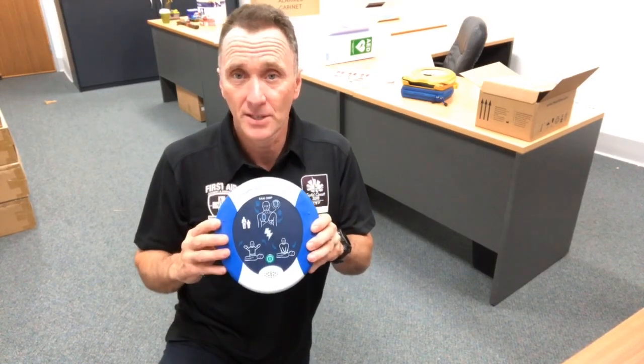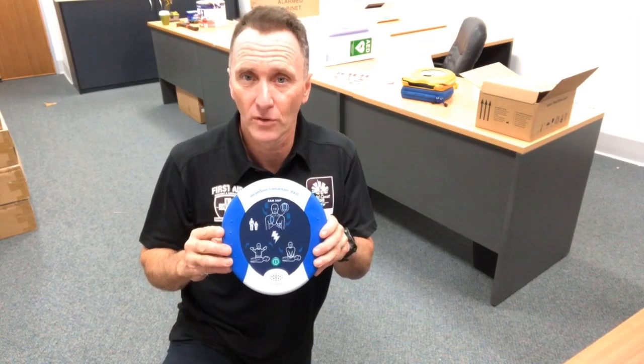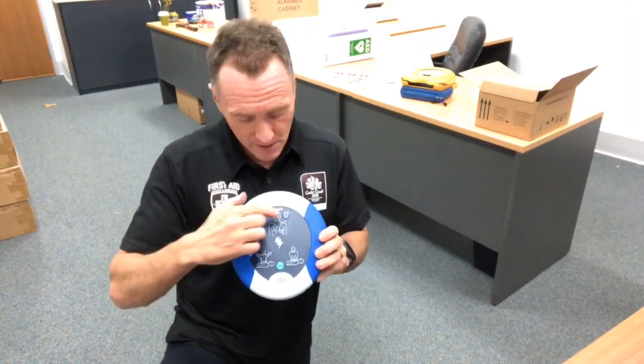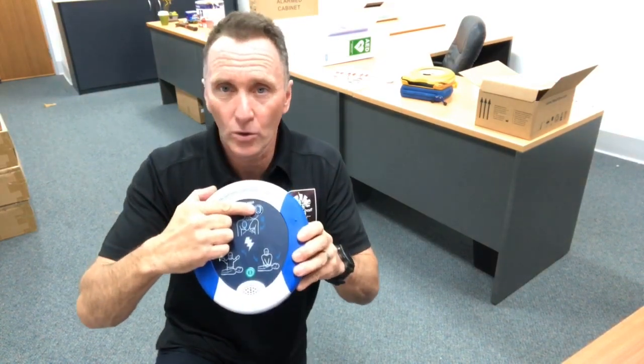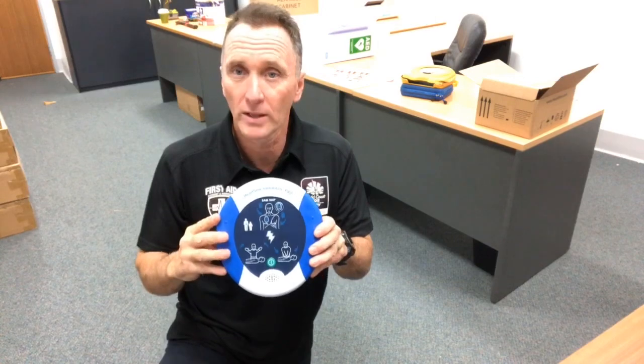If the device performs a self-test and detects a fault — whether in the battery or the program — the indicator will no longer flash green; it will flash red and beep loudly every 10 seconds. If your device is beeping every 10 seconds, notify Parkrun Australia immediately and they'll organise to send a new pad and battery pack for you to exchange in your device.